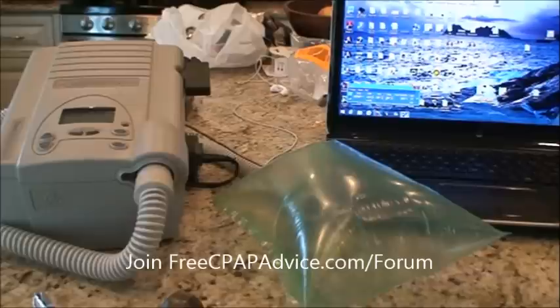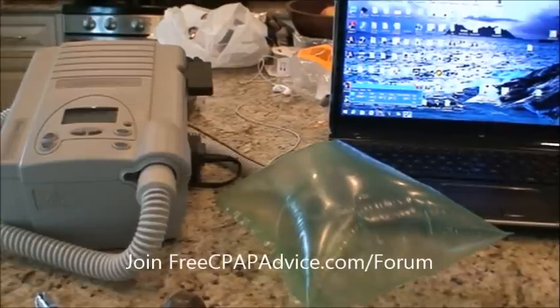So I have a little experiment I want to show you. It has to do with increasing the pressure. If you have a leak, the CPAP is constantly making calculations to try to keep you at your pressure. So if you're on 10 centimeters of water pressure and you have a huge mouth leak, the machine is going to increase to try to make up that difference. If your mouth opens more and it keeps leaking, it's basically going to be an endless cycle. It's going to keep turning up, more air is going to leak out, and it's never going to be able to catch up. All right, so this is my setup.